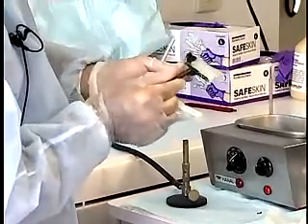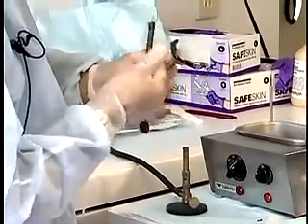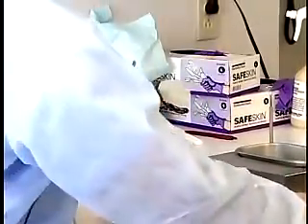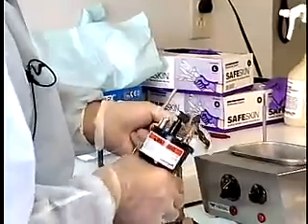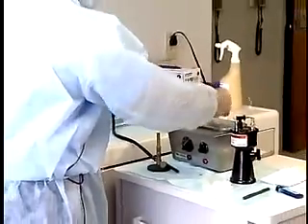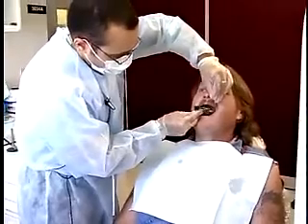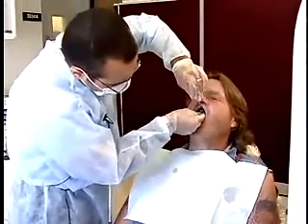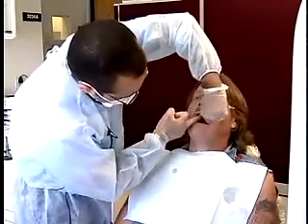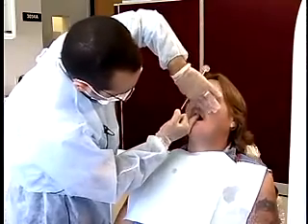Shape the compound with a wet finger, flame, and temper it. Reflect the cheek with a mouth mirror and seat the tray. Grasp the cheek at the corner of the mouth and draw outward, downward, and inward.